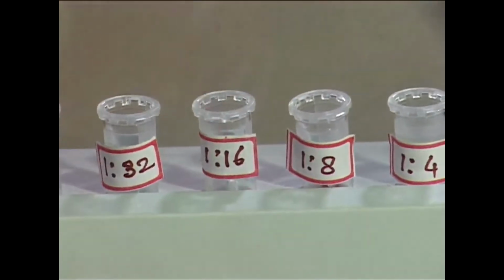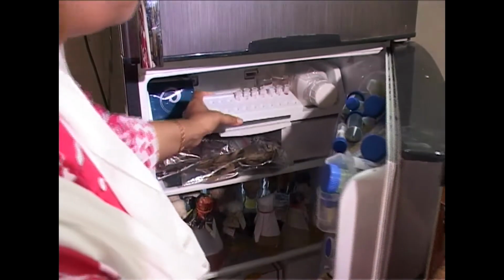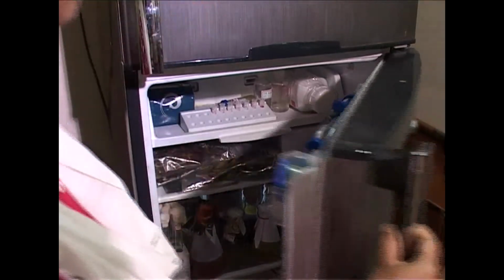After addition of red blood cell suspension, we have to incubate it for 30 minutes at 4 degrees centigrade for virus, and at room temperature or optimal temperature for bacteria. We have to incubate it at 4 degrees centigrade for virus because many viruses possess the enzyme neuraminidase. This enzyme causes detachment of the RBC from the virus particle. For those viruses, we have to incubate at 4 degrees centigrade.